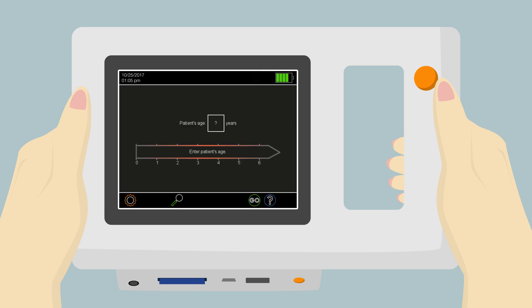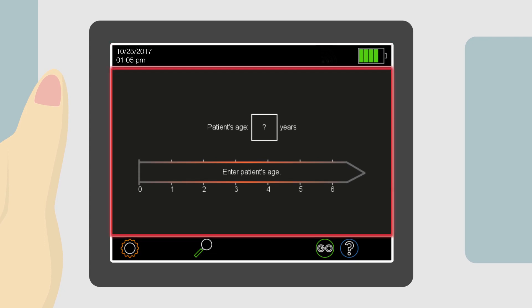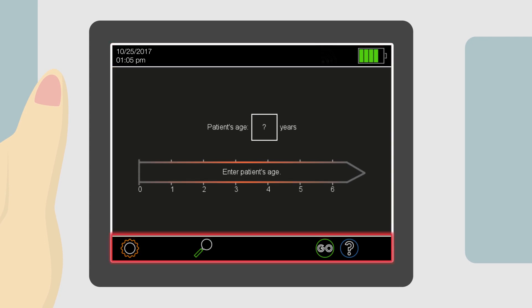This is the home page. From here, we can adjust the settings of the device or start a new screening session. The screen is composed of a header bar, an information section, and a navigation bar.